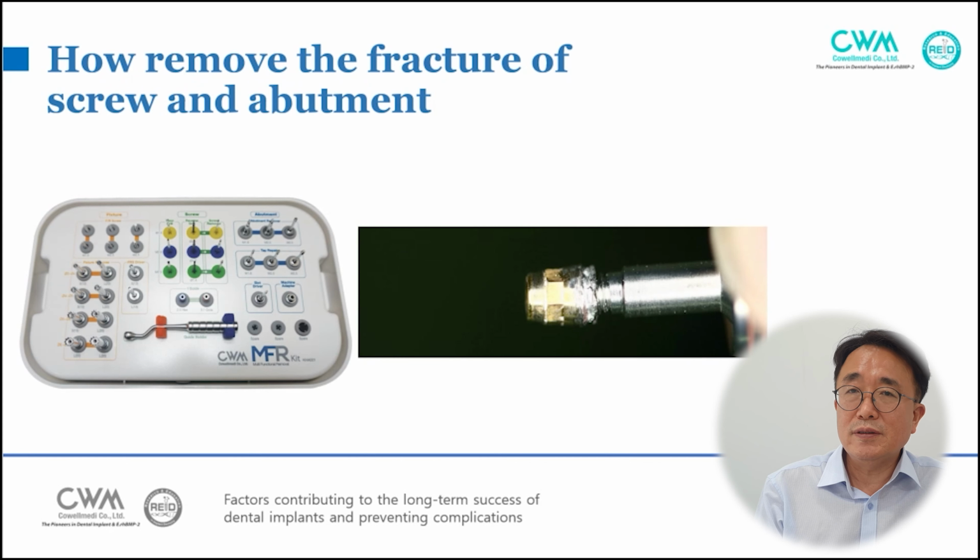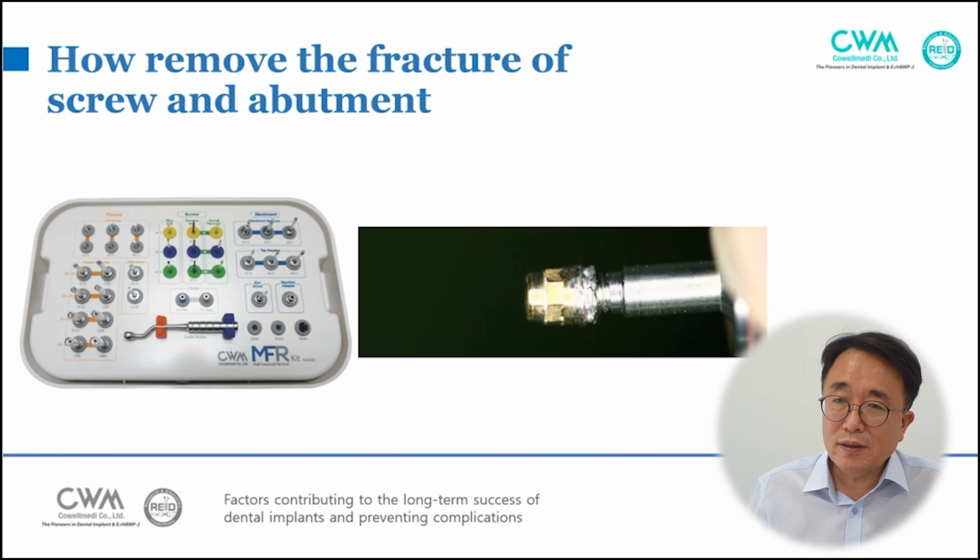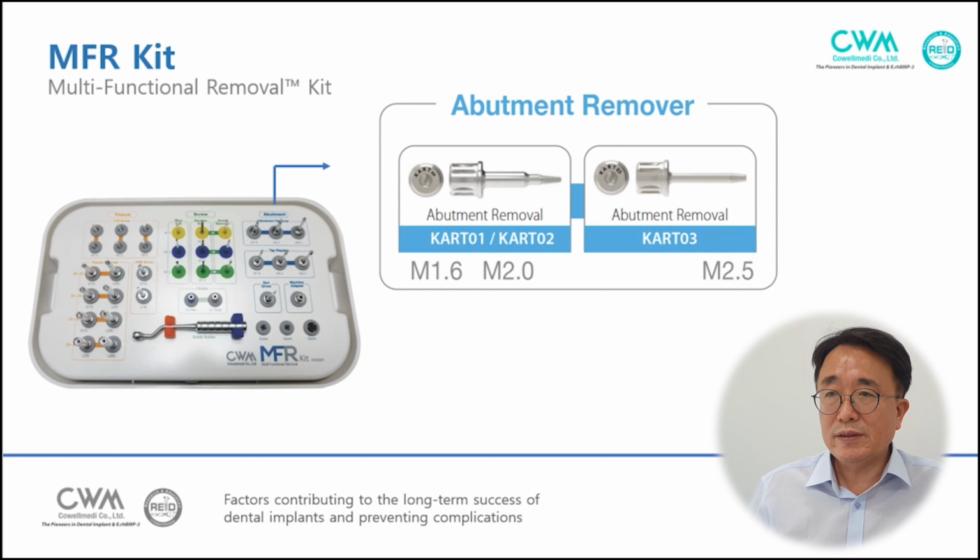How to remove the fractured screw and abutment? We have to use a multi-functional removal kit. The abutment remover is a tapered, reverse direction thread type ratchet drive.